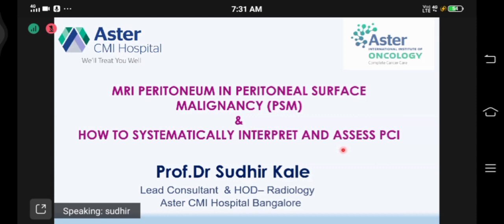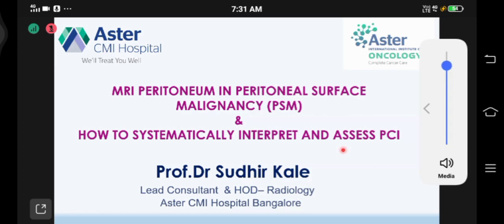Thanks, Navneet. Thanks, National Board. Welcome all here for today's quite an interesting session on MRI peritoneum in peritoneal surface malignancy and how to systematically interpret and assess PCI.